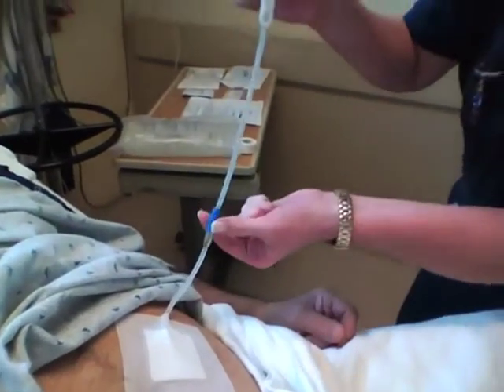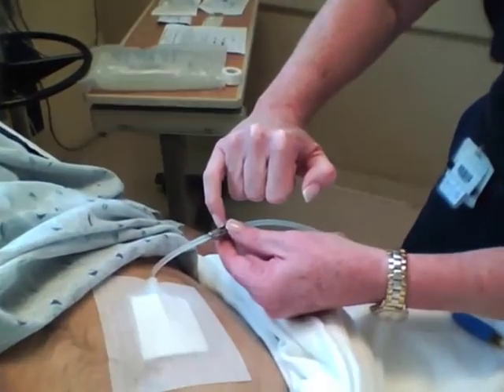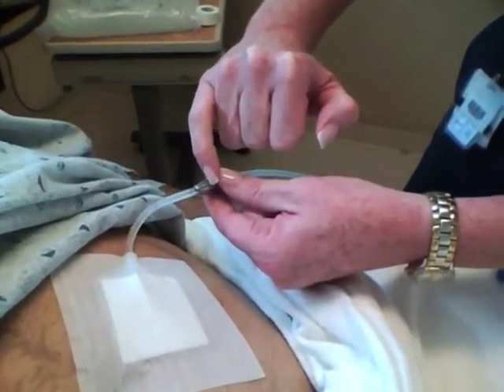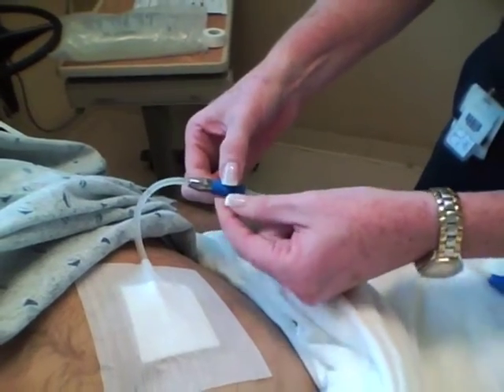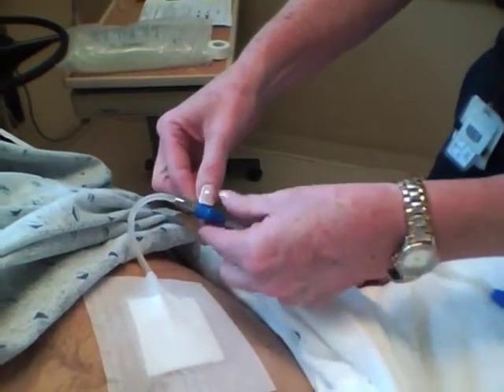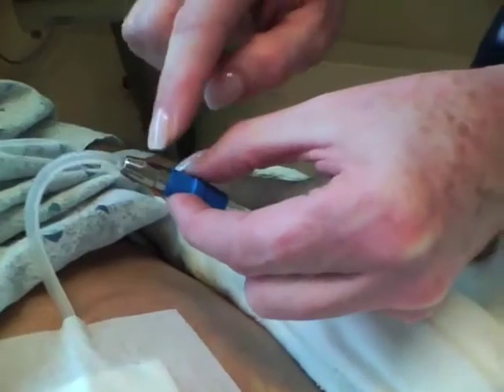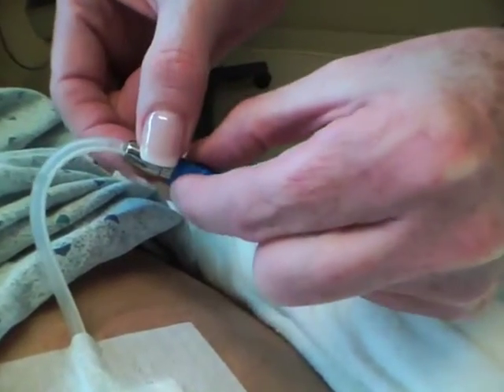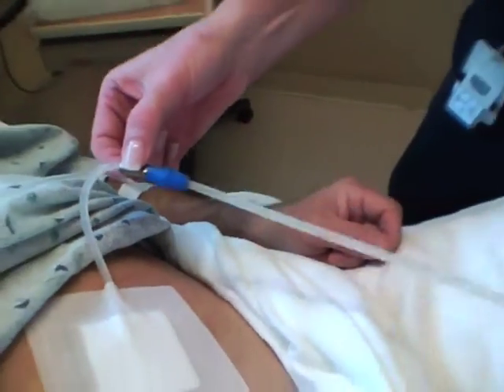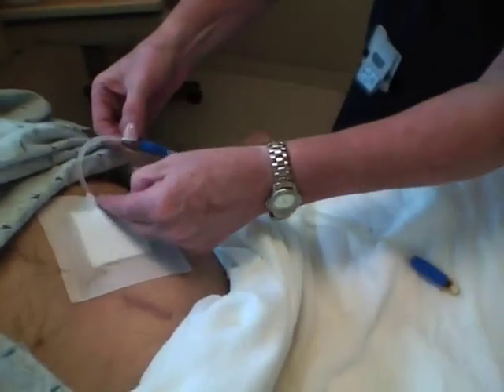This here is actually the Tenckhoff catheter, and this is the titanium adapter on the Tenckhoff catheter. All of this is not disposable — this actually goes into the peritoneal space. From this blue area on, this is the titanium; from this blue area on is a disposable piece. This area here is not disposable.